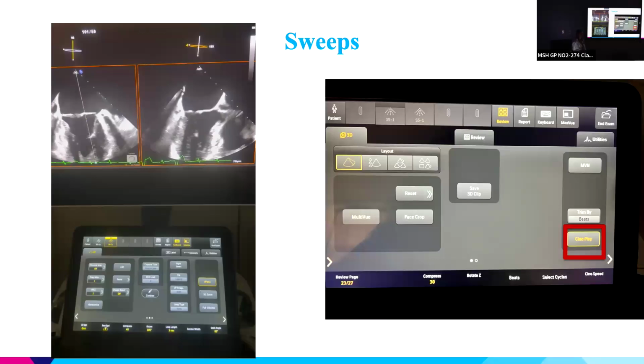It's my understanding that for what you were acquiring in general, it is putting all the images into some sort of buffer, so that when you freeze, you can use the trackball to go backwards. Yes, but it's not forever, but it goes for a fair time. If you then unfreeze, you've lost it and you're starting from zero.